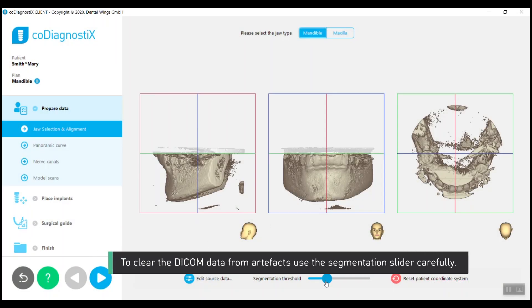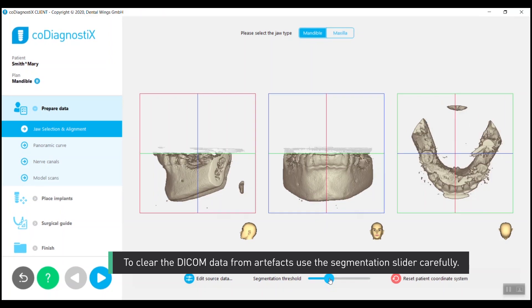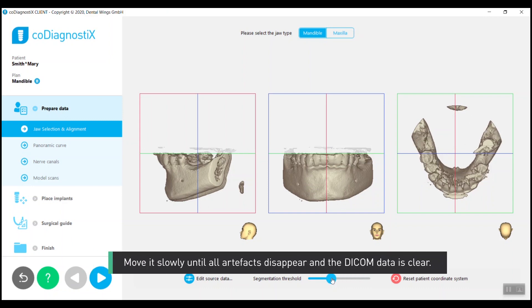To clear the DICOM data from artifacts, use the segmentation slider carefully. Move it slowly until all artifacts disappear and the DICOM data is clear.